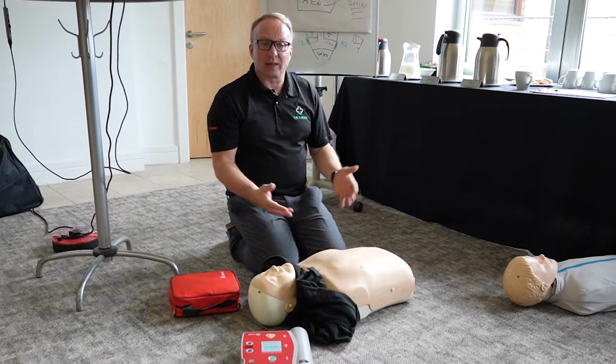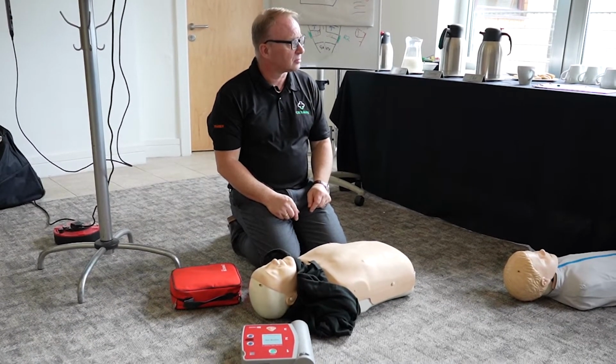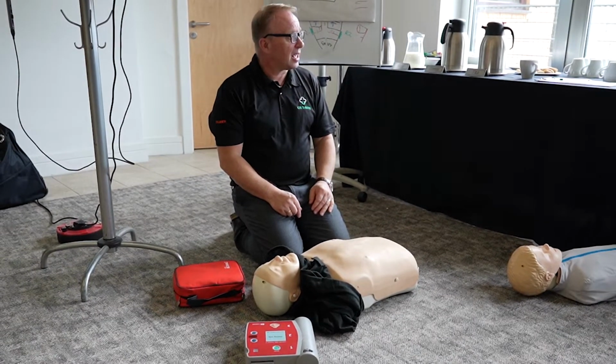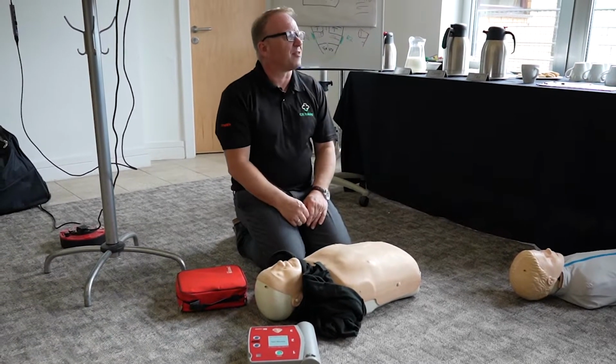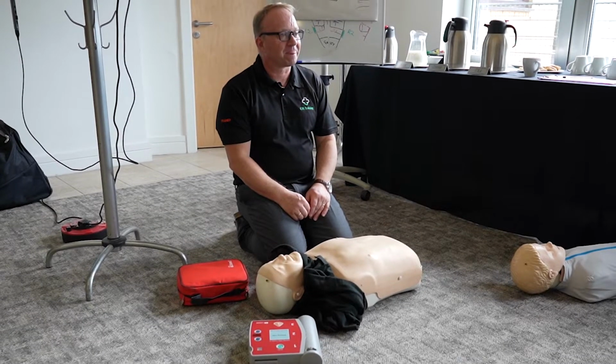Piercings? Okay, so what, like what? Nipple piercings, do they have to come off? They don't. They're not in the way. You'll see in a minute, they're not in the way. And it'd take too long, wouldn't it? Take far too long. Anything else? Any other considerations?